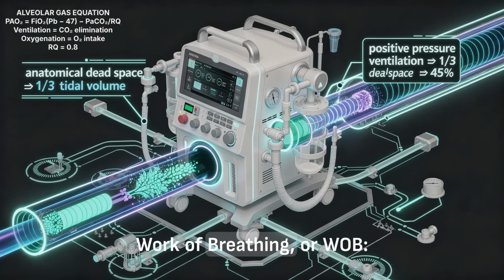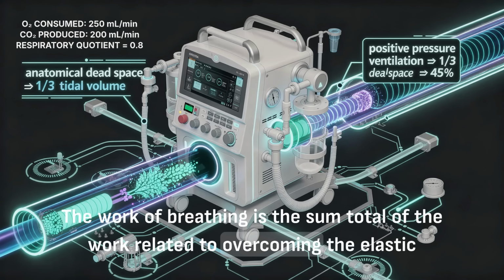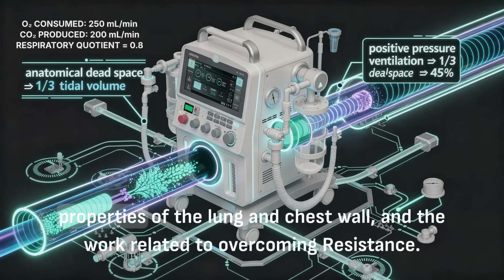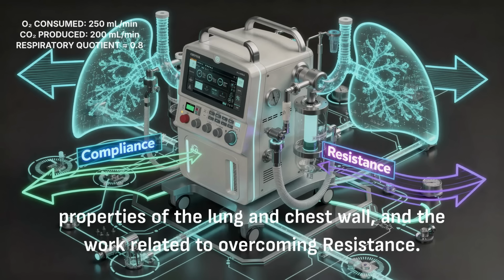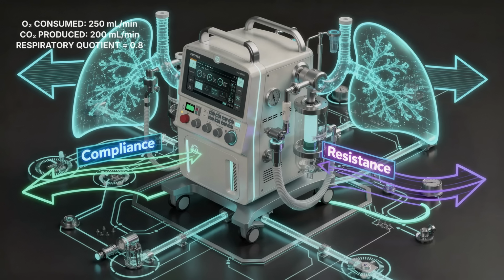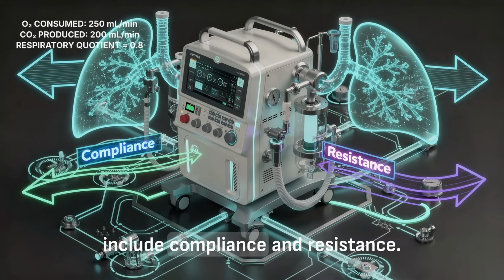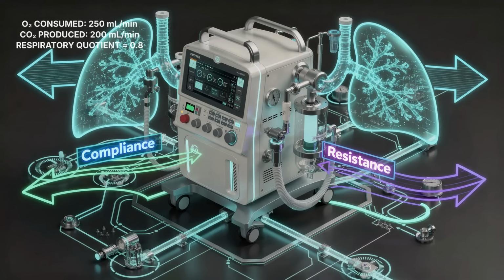Work of breathing, or WOB. The work of breathing is the sum total of the work related to overcoming the elastic properties of the lung and chest wall, and the work related to overcoming resistance. The whole purpose of the ventilator is to perform the work of breathing. The two distinct impedances that have to be overcome by the ventilator include compliance and resistance.